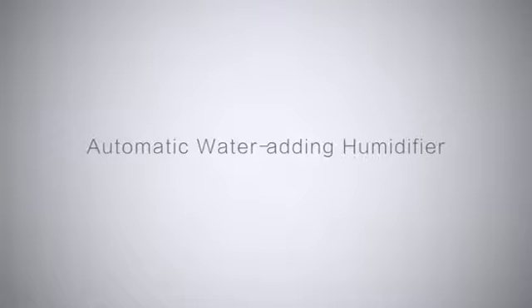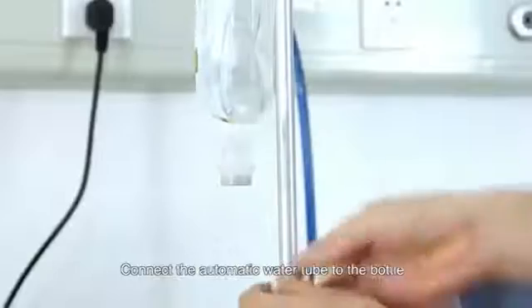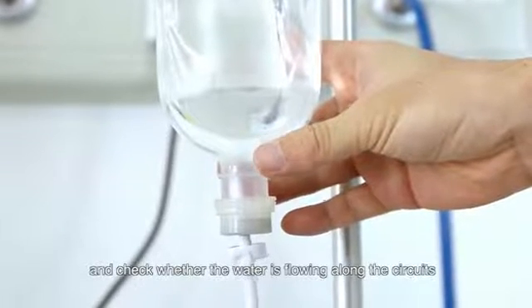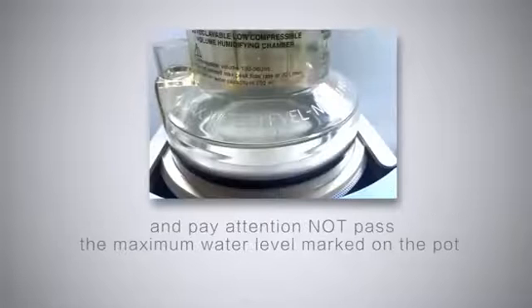There are two kinds of humidification pots. One is able to add water automatically and the other one manually. Automatic water adding humidifier: hang the sterilization water bottle on the water bag bracket. Connect the automatic water tube to the bottle. Open the pressure port of the tube and check whether the water is flowing along the circuits. Manual water adding humidifier: inject sterilization water into the humidifier and pay attention not to pass the maximum water level marked on the pot.